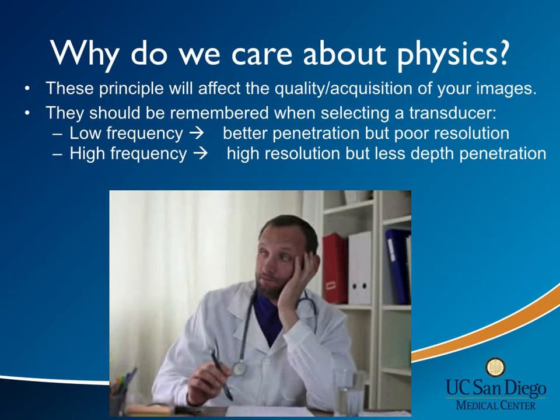I'm sure you're asking yourself at this point, why does any of this matter? Just remember, having a basic awareness of these concepts will help guide how you perform your studies, help you to select the best transducer for your studies, and hopefully optimize the information you gleaned from them.